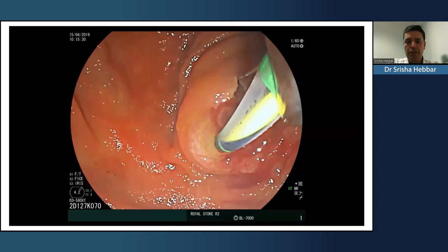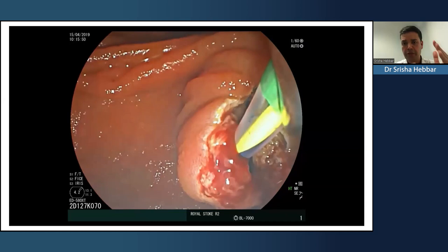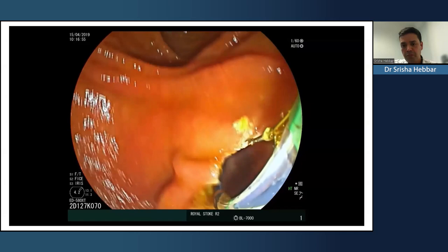So it was important in this case that we don't do a small sphincterotomy. If you try to pull a bigger stone through a small sphincterotomy, you're going to cause problems. So it's important that the sphincterotomy is very effective, but you need to know where the limit is where you can safely cut. So cut a little bit, put the sphincterotome back in, bow it, pull back, and reassess to see how much more you have got to cut. Here, I think we've just done it, that's the limit. You can't go more than that.